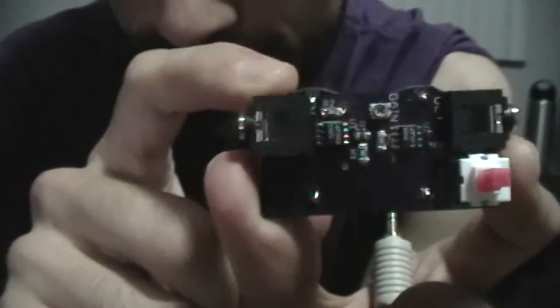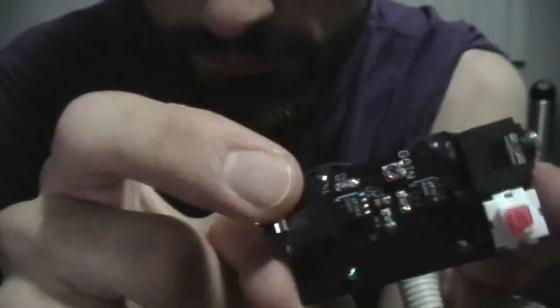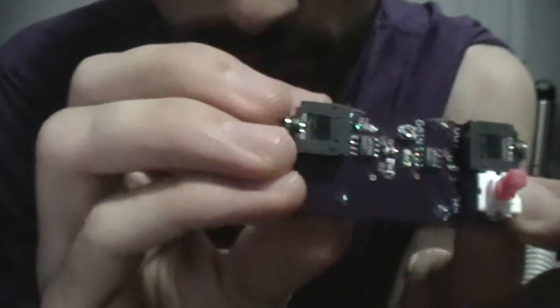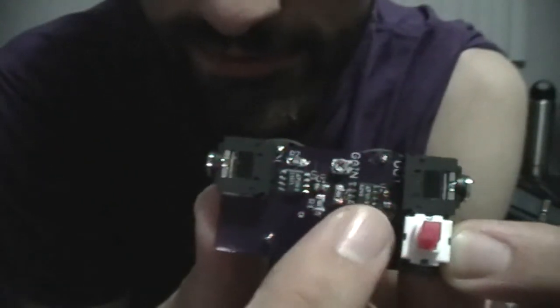So here's the EMG device that I've been working on. It runs on two CR2032 batteries. There's two op-amps on it, one instrumentation amplifier.